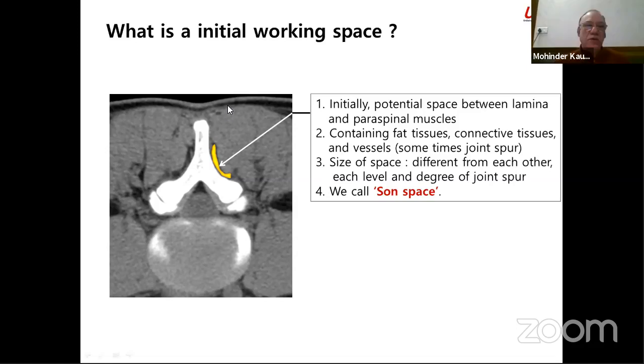Dr. Rohidas, please. Don't confuse between the fluid medium and dry medium. Whichever method you are comfortable with, follow it. In fluid, Lokhande just mentioned that there is absolutely no bleeding. This is because of irrigation. There is bleeding, but you keep the irrigating fluid in such a way that you think it is a bloodless field. Still, there is bleeding from the bone and the muscle. You have to use RF, you have to use the cautery. In dry, you have to keep the field as less bloody as possible. You have to do hemostasis and use various methods. So for each medium, you have to follow its basic principles.